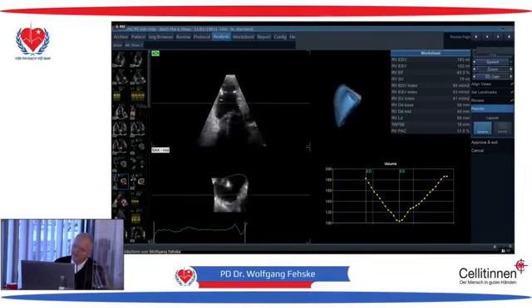So the diagnosis in this patient is clear now. The patient definitely has a RCA infarction with an inferior area of scar in the left ventricle. The overall pumping function of the left ventricle is a little bit reduced, but the mitral valve is okay. The aortic valve was also okay. We saw it already, but the RCA infarction was a proximal RCA closure. That means the whole lateral wall of the right ventricle, as you can see here, is completely scarred, so that the ventricle has only an active part, which is the septum, and all that is akinetic.